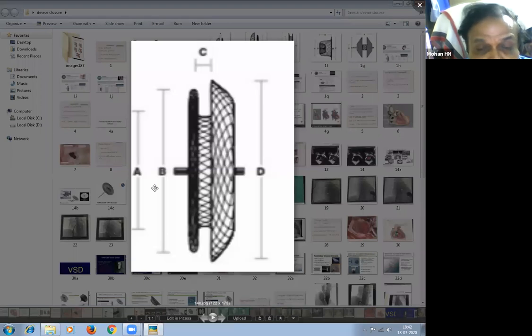Not only if the pulmonary artery pressure drops, but can we do the device closure? We have to check the LVEDP also. Sometimes there is LA overload, which will be a problem for the patient. LVEDP also should not elevate. So you have to take the LVEDP simultaneously while inflating. If the pulmonary artery pressure drops but the LVEDP also elevates, we should not do it.